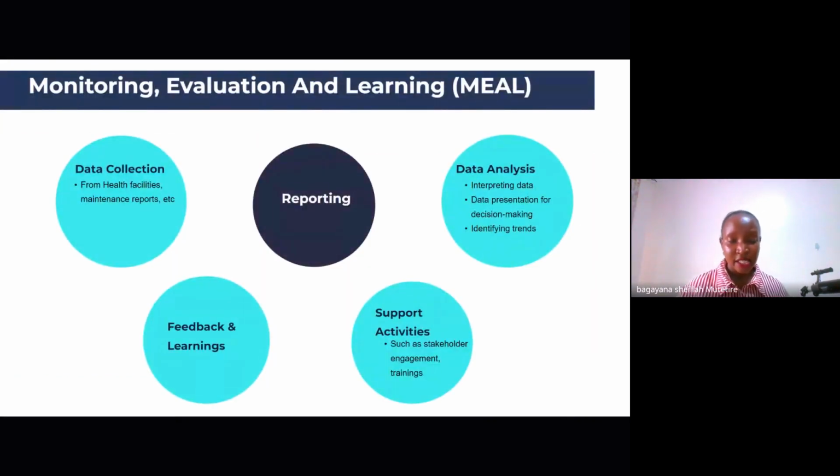So data documentation has been really key and is central in the work that we do. From data collection at the facility, at the sites, and also with our technicians as they go out, at the office, managing the inventory, managing the spare parts inventory, all this data has been important for feedback and learnings. We've understood so many things, and we're able to use some of our software to generate reports. So we can see the facilities that have the highest usage, the facilities that have the highest breakdowns, and we can come in and try and understand what exactly is happening.